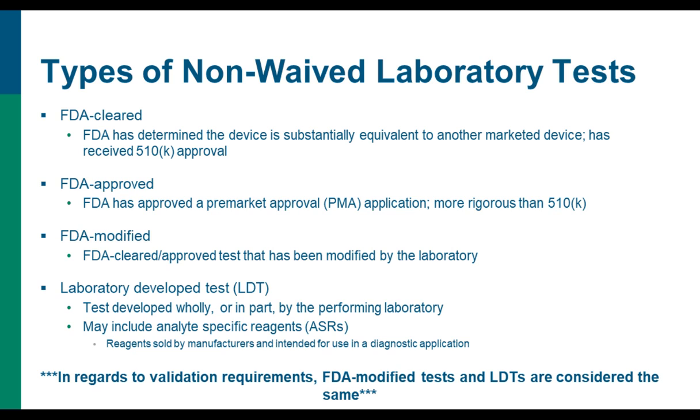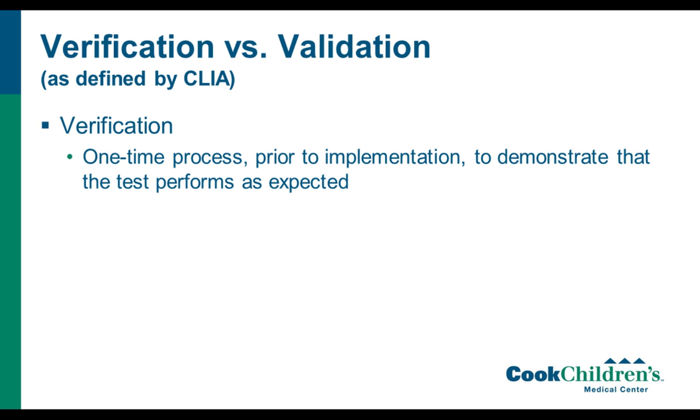And in regards to validation requirements for what we're concerned about in the lab with bringing in new tests, FDA-modified tests and LDTs are considered the same. So I've had people try to argue in the past that because the test was FDA cleared, they don't have to do as stringent a validation as for a laboratory developed test. But actually, as soon as you modify it, it becomes off-label and treated like an LDT, and we will talk about that as well.